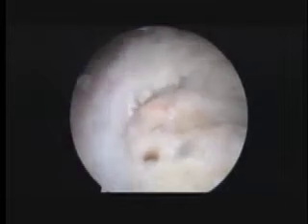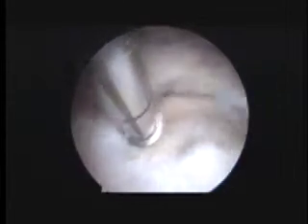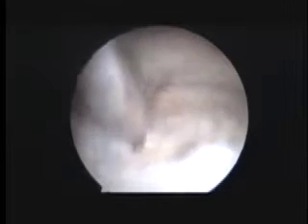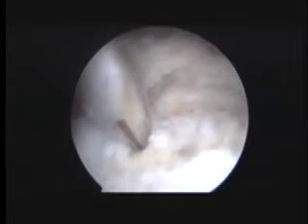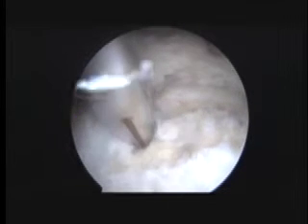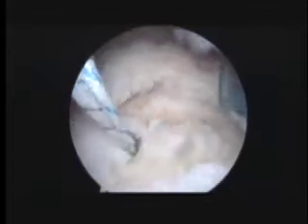Okay, so that just makes a little starter hole in the bone. And the next step is to go ahead and screw down the suture anchor. You'll see that come into the picture right there. That's what we actually place into the hole we just made. Just like that. We'll go ahead and unload the screwdriver next. And that gives us 3 sutures to work with. You can let go. We'll go ahead and spread these apart and decide which ones we're going to work with in what order. So we're going to go white, black, blue.